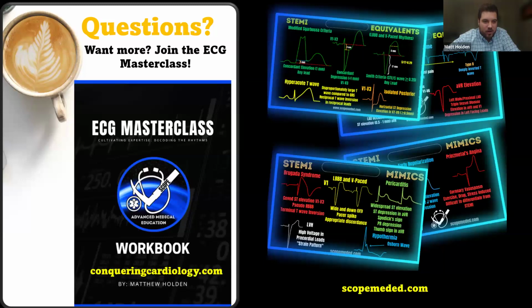And I am down to the last 4 minutes. So Jen, if anyone has any questions, yeah, it looks like Facebook and not Instagram. After you point them out, you can't unsee them exactly. Does anyone have any big questions? Take advantage of getting your advanced EKG questions answered by the master.